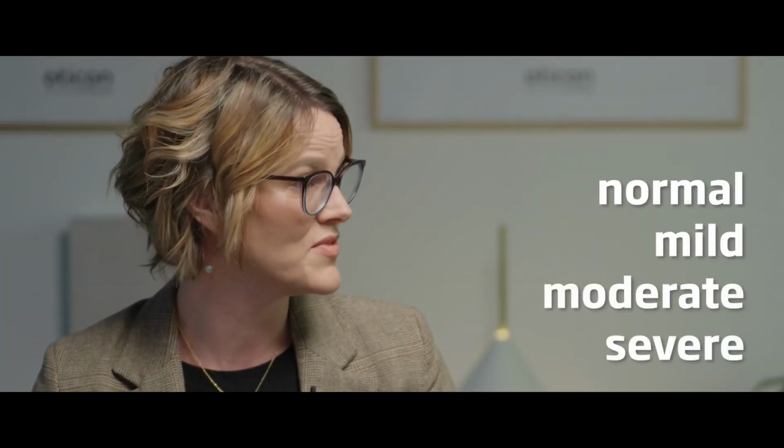client will need. Yeah. It's a good thing you mentioned that, because we have different severity categories when you do an ACT measure. And they're very familiar terms, right? Yep. It's normal, mild, moderate, and severe. Yep. So they correspond to what we already know and use in pure tone audiometry. So it's very familiar to us, these terms. Yeah. Okay, so the higher the ACT value, the more help in noise the individual would have prescribed.